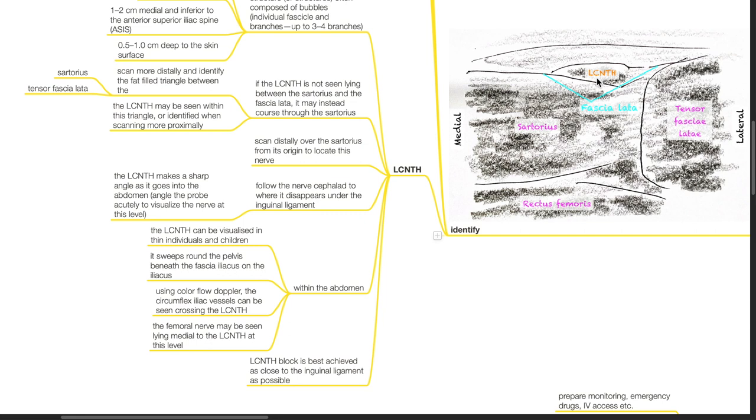Using color flow Doppler, the circumflexed iliac vessels can be seen crossing the LCNTH. The femoral nerve may be seen lying medial to the LCNTH at this level. LCNTH block is best achieved as close to the inguinal ligament as possible.